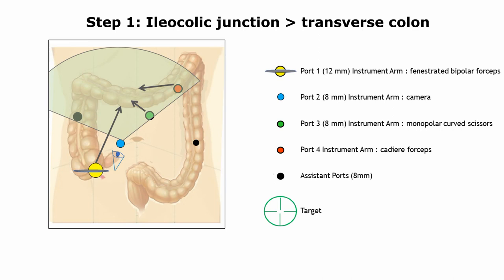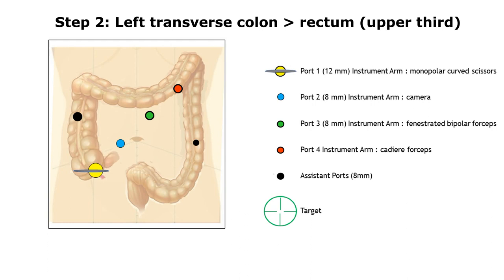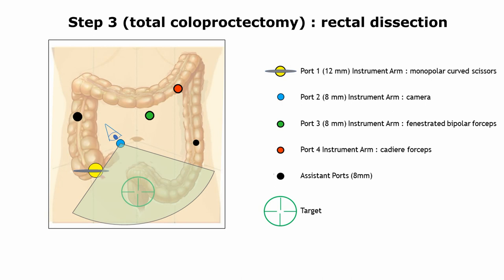A second docking is subsequently performed after rotating the robotic boom without moving the patient cart. A first targeting pointing the left colon allows the surgeon to completely detach the splenic flexure and to complete the dissection of the descending and sigmoid colon onto the superior part of the rectum. In case of associated proctectomy, a third targeting can be done toward the pelvis. In this case, the fourth robotic arm is replaced on the left flank port, and two assistant ports are then available to help the surgeon and facilitate the pelvic exposure and the rectal dissection.